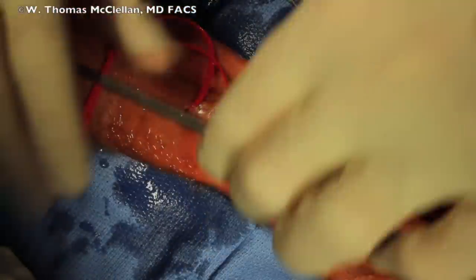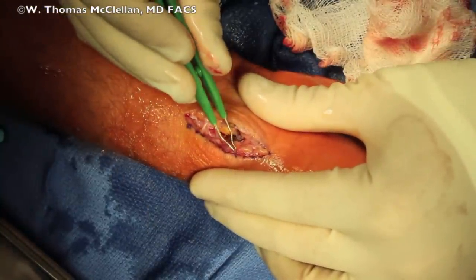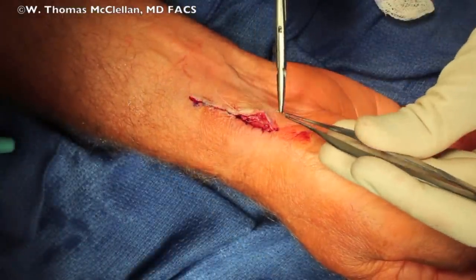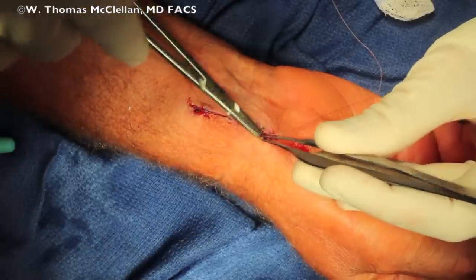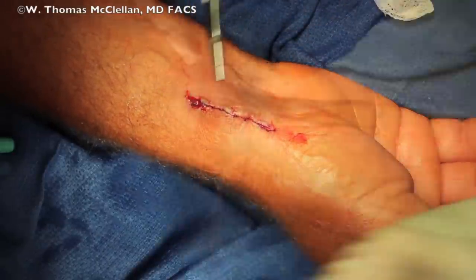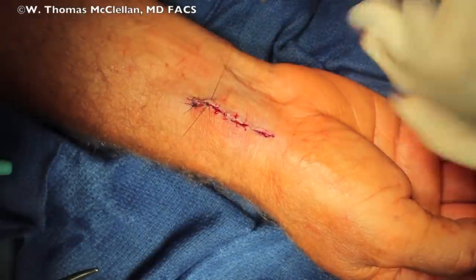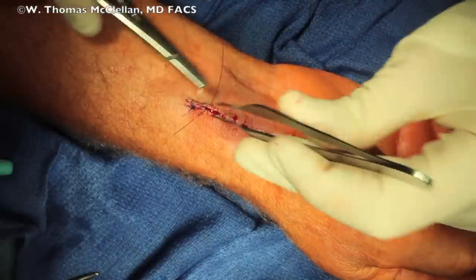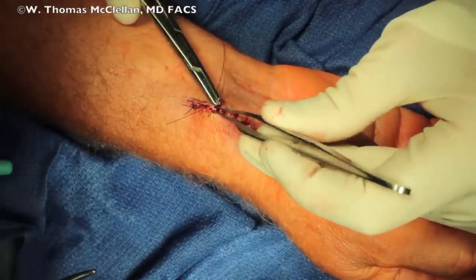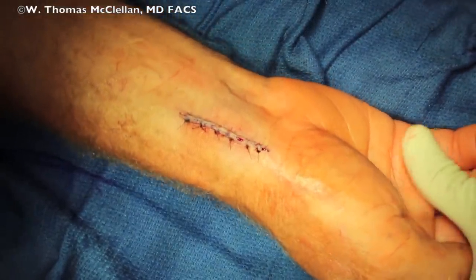I then let down the tourniquet and wash out with copious amounts of irrigation. I remove the vessel loop and perform hemostasis with bipolar electrocautery. I place a 5-0 deep vicryl stitch to bring the wound together. I've tried all sorts of different ways of closing these wounds using monocryl in an subcuticular fashion; however, I think the horizontal mattress suture with nylon sutures gives the best long-term closure. Here's the mattress suture going in — it takes a little bit longer to close, but I think you get a superior scar result. And here's the wound closed, showing good re-approximation and the cyst being excised.